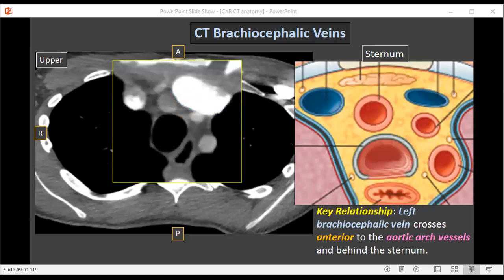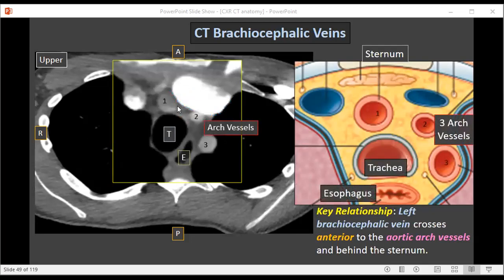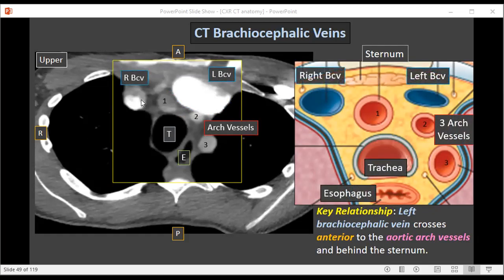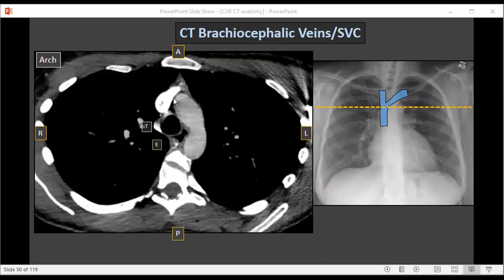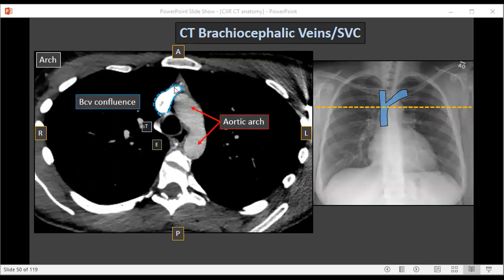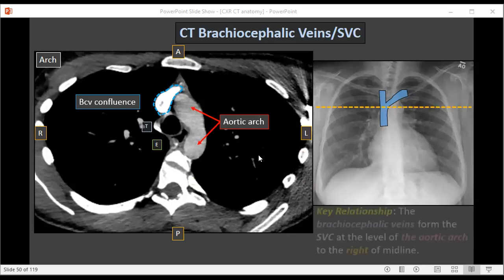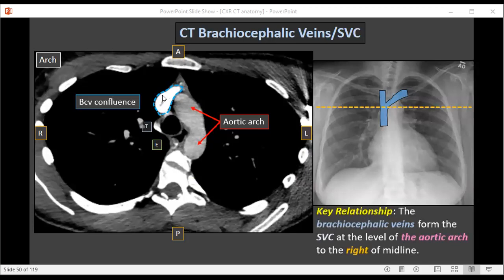Blowing this area up, we can see the three aortic arch vessels, the trachea, and the esophagus. In front of the arch vessels is the left brachiocephalic vein, and just to the right of midline — to the right of the trachea — we can see the right brachiocephalic vein. This is a key image and an important relationship to understand. Coming down further, the brachiocephalic veins come together on the right side of the body to form the SVC at the level of the aortic arch. This reflects the confluence of the brachiocephalic veins — we're seeing a portion of the left brachiocephalic vein as it comes together with the right brachiocephalic vein to form the SVC within the upper chest. The key relationship: the brachiocephalic veins come together on the right side of midline at the level of the aortic arch to form the SVC.